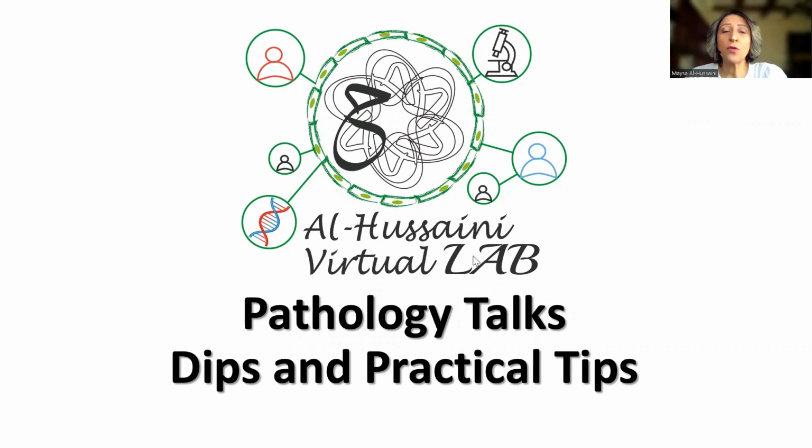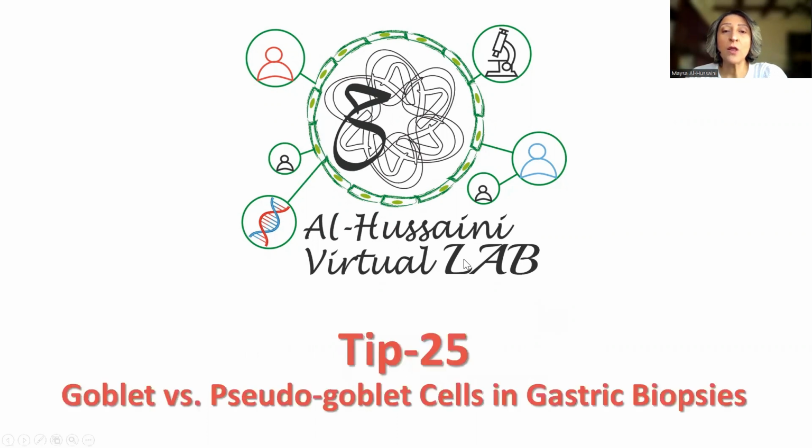Today, I'm going to share with you a very interesting tip that I recently came across. This is when we encounter goblet versus pseudo-goblet cells in gastric biopsies. We all know that the presence of goblet cells would mean intestinal metaplasia in gastric biopsies, with all the risks for the development of subsequent malignancy. Now, it's important to differentiate from what is known as pseudo-goblet cells. So how can we simply sort out this differential diagnosis?